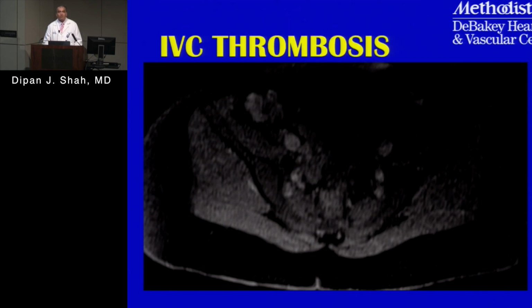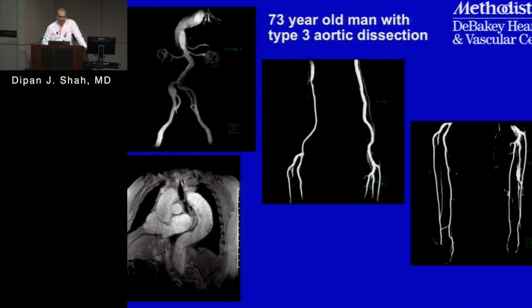Okay. You still need the contrast. Yeah, you need contrast. The blood gets opacified. Correct. Exactly. Yep. Okay. So here's a case now.